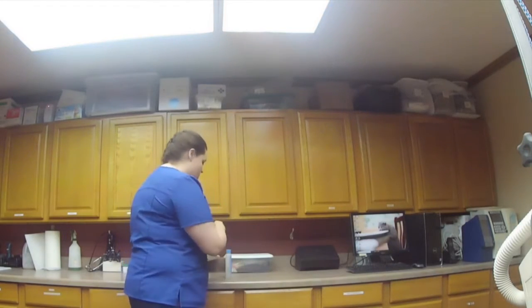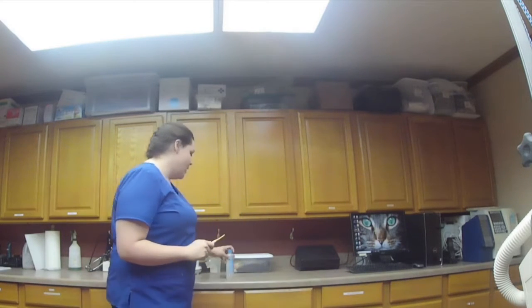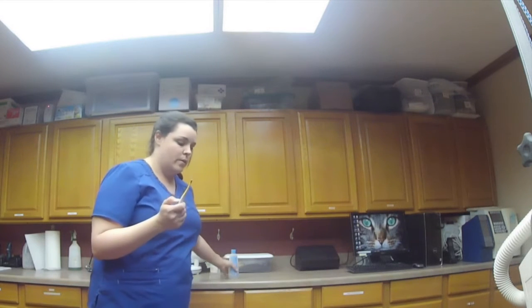Thermometers, so we use a digital thermometer here at the clinic. It works pretty fast, which is helpful if you have an upset animal, upset patient. They work quickly. Normal for dogs and cats is 101 to 102.5. Anything above that is a cause for concern. What you do is we put a little bit of lube on the end of the thermometer, and then we put it in their rectum and let it do its thing.